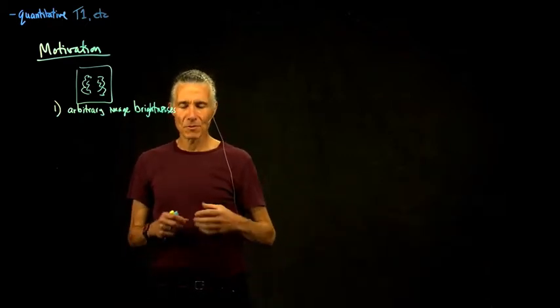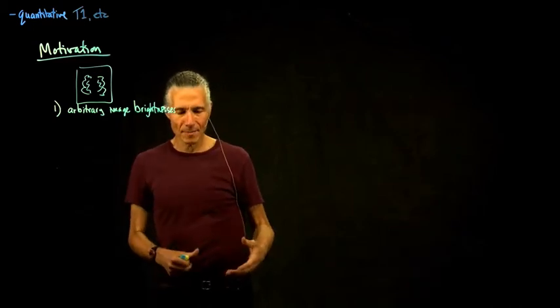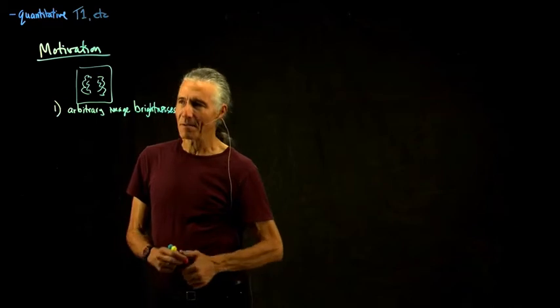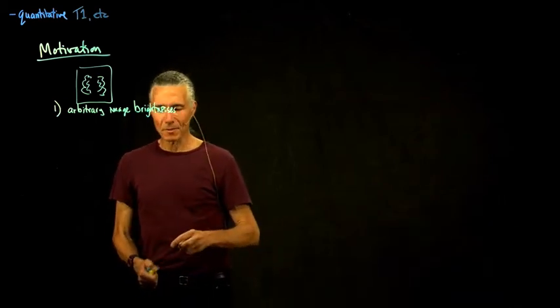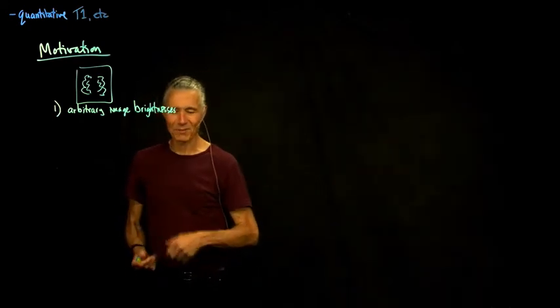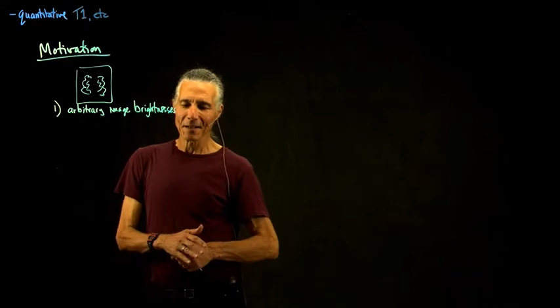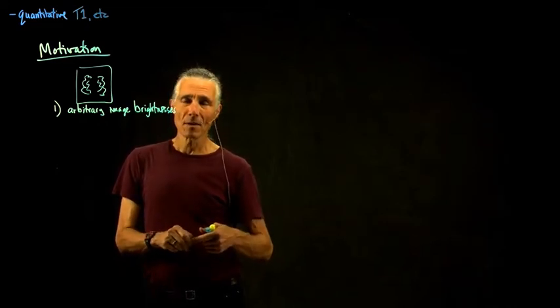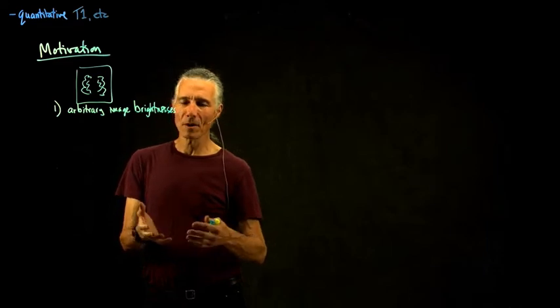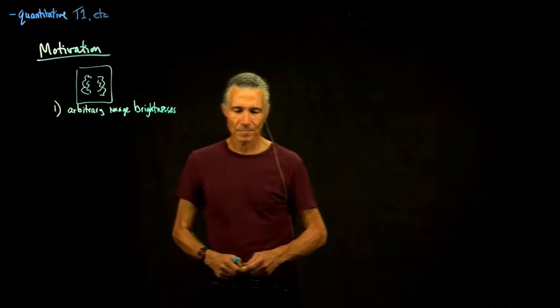So in particular, there's no way that you can do the following. You scan somebody one year, and then you come back the next year and scan them again, and then you actually can say, well, yeah, your brain has gone downhill. I was watching the video from last year. It's time to stop drinking, something like that. You can't directly compare across time. And also, just as important, you can't compare across scanners, because scanners have different conventions.